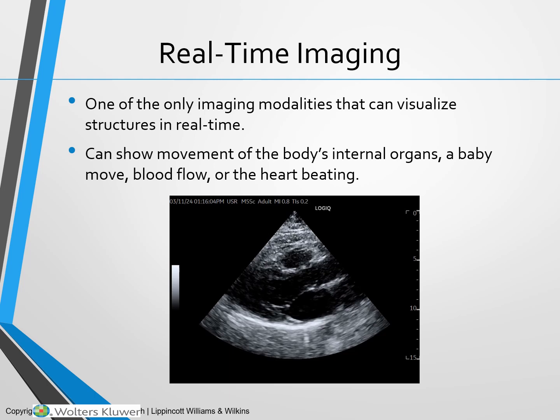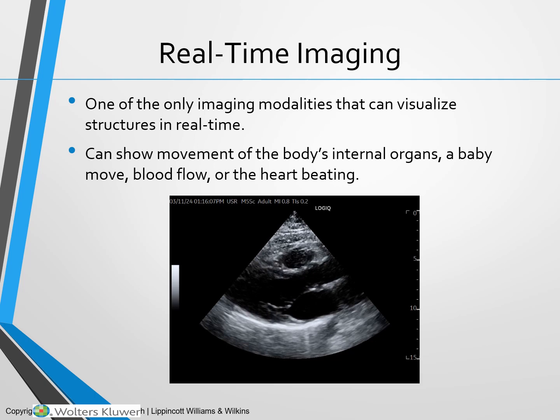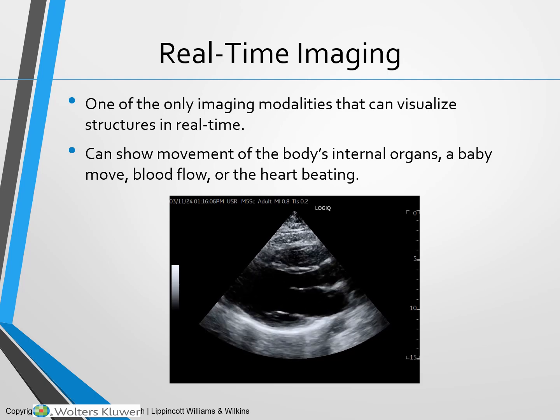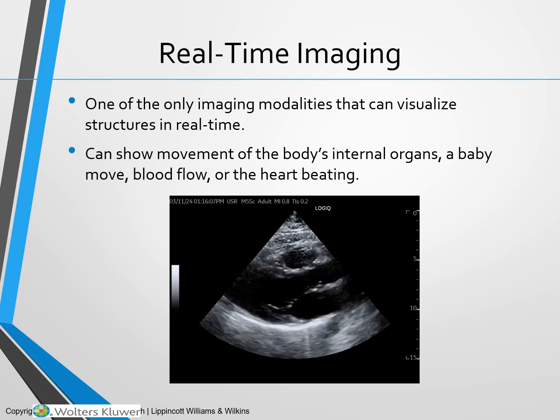Ultrasound is one of the only imaging modalities that can visualize structures in real time. It can show movement of the body's internal organs, a baby move if they kick or roll. We can show blood flow throughout the vessels or through the heart, and we can even show the heart beating. So here is a video where you can actually see the heart moving. You can see the valves on the heart, and this is called real-time imaging.